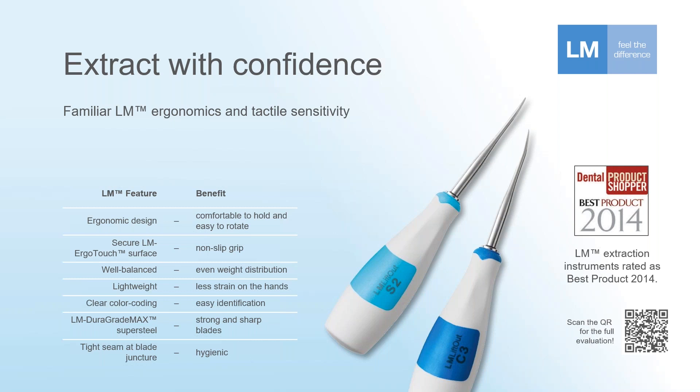Here are some of the main features of these instruments that have been very helpful in a clinical environment. The overall handle design is very comfortable to hold, and the size and shape makes it easy to rotate as well as to pass back and forth. The handle is made of a resin-type plastic; however, it has that LM ErgoTouch surface — that white area you see is a grippy, non-slip surface.